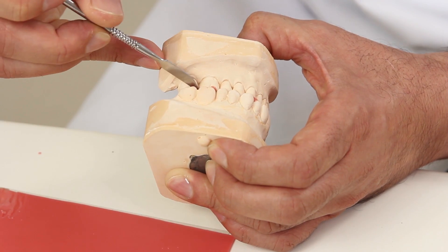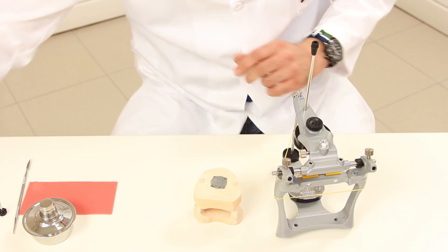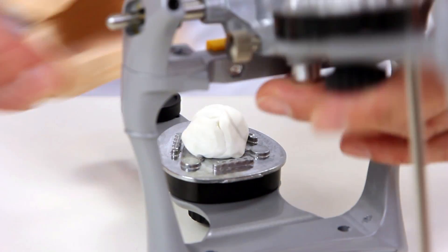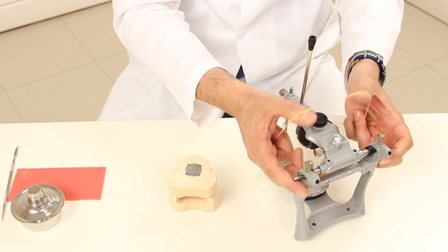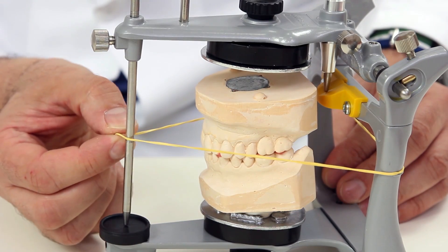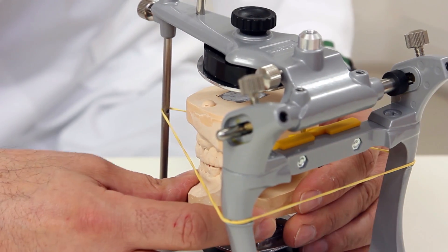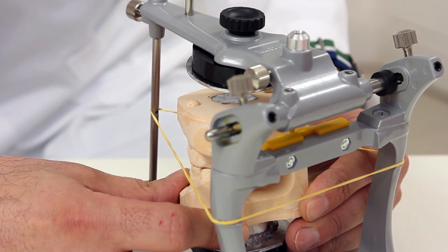Now we can position the models to be plastered. We properly position the models by putting some modeling clay on the lower part. And to have them in the best possible position, we put a rubber band around these notches. And in the central part, using the camper's plane — a plane parallel to the occlusal one. Once the position is found, we are ready to plaster the upper part of the articulator.